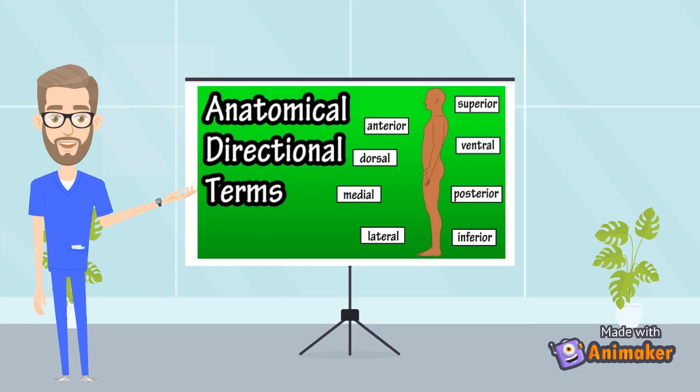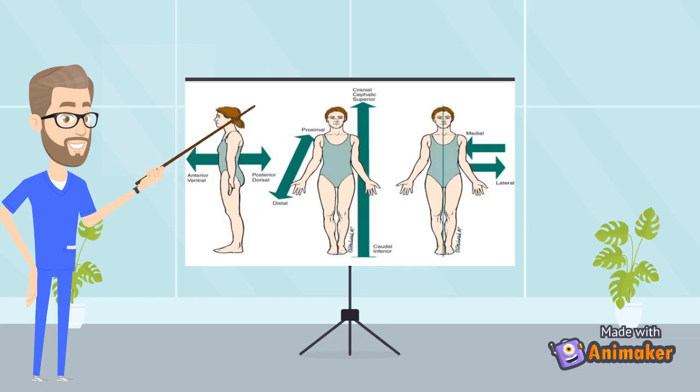The week 1 introductory lesson gave us the objectives of learning anatomic imaging planes, terms used for patient and transducer orientation, positions used for scanning our patients, and directional terms to describe where something is located. We use directional and locational terms in the medical field so everyone is on the same page when it comes to an understanding of where something lies.